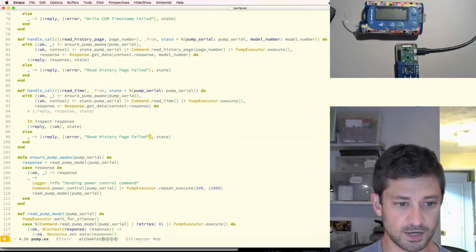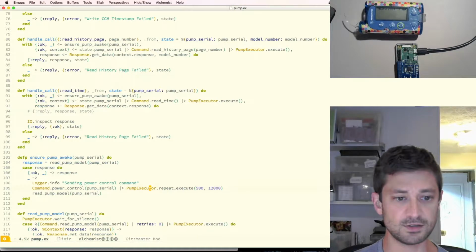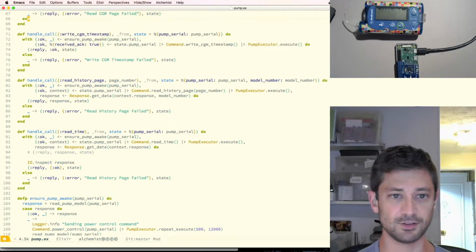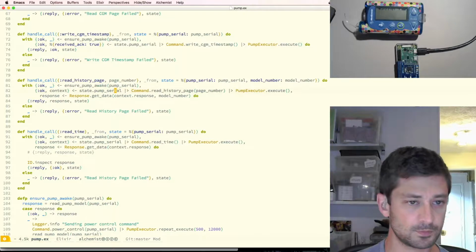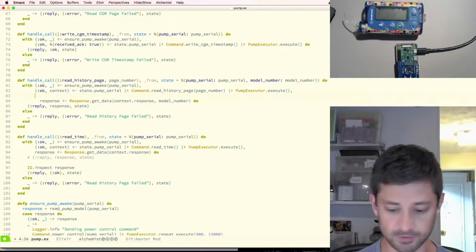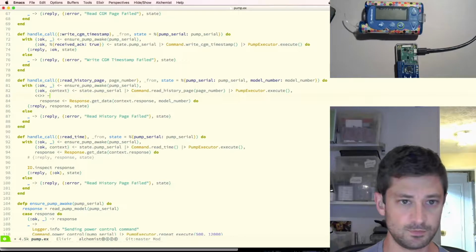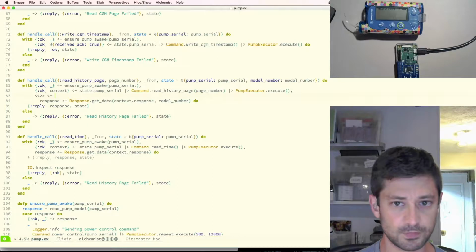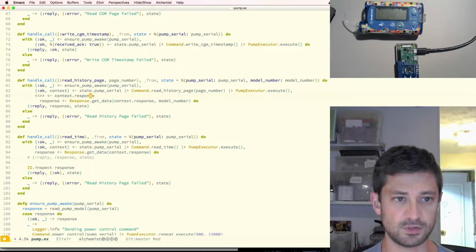Which means either in my date decoding or here in the pump, I need to handle not passing all of that stuff in. And I think this is the right place to do it. So I just have to think about how I want this to work. I'm also not entirely sure what I can do with with yet. So this should be interesting as well. I think I can pattern match here.